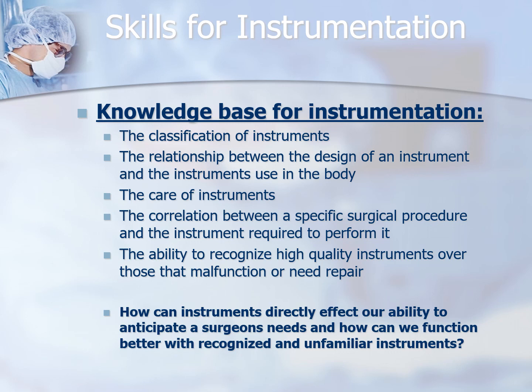The relationship between the design of the instrument and the instrument's use in the body. Remember, we think about tissue, we think about depth, we think about surgeons' preferences, and we go by our experiences as well. It's important that we care for the instruments intraoperatively, that we make sure that they don't get damaged and they're not being used for things that they're not supposed to be used for, like a needle holder trying to bend a plate that we're going to use to fix a bone with. It's not meant for that. There's special instruments that are meant for that.